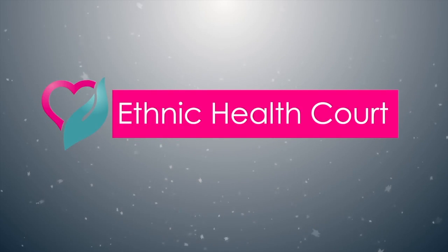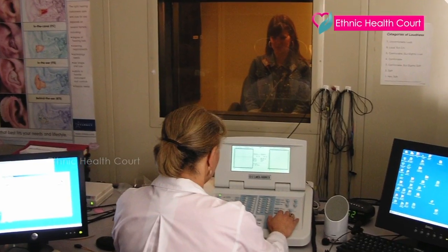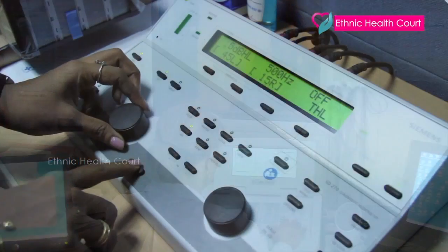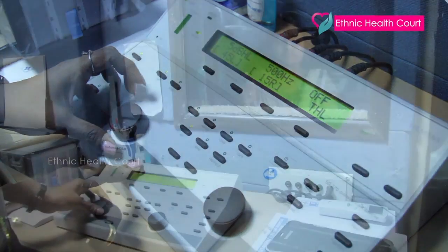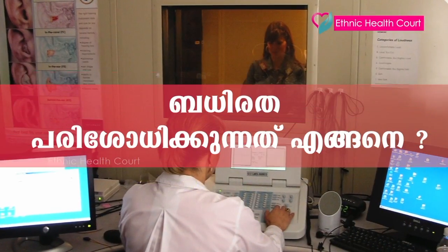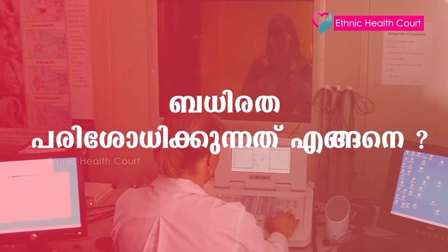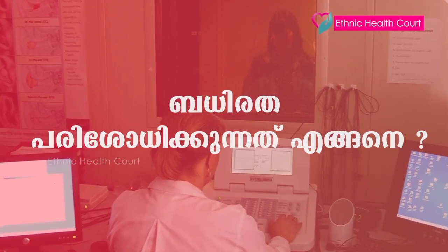What is an audiometric test? I am impressed with the audiometric test. In a soundproof room, you can perform audiometric testing.